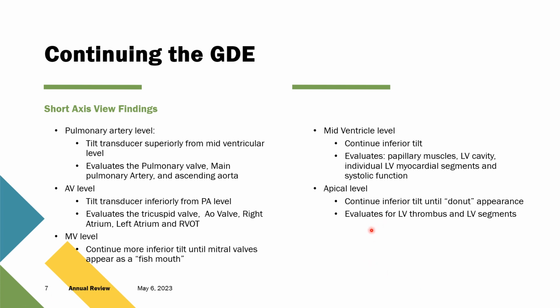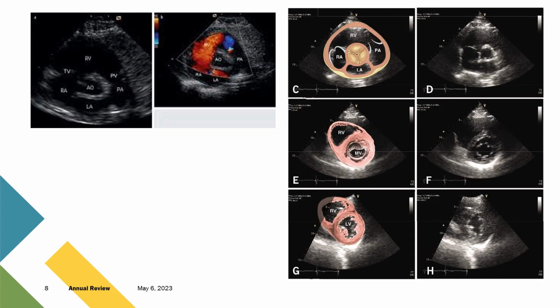One of the things in this region that you may find is a left ventricular thrombus if there happens to be some stasis from poor cardiac contraction. This would be a general region where you might find that. And here's just a presentation of those particular views again.